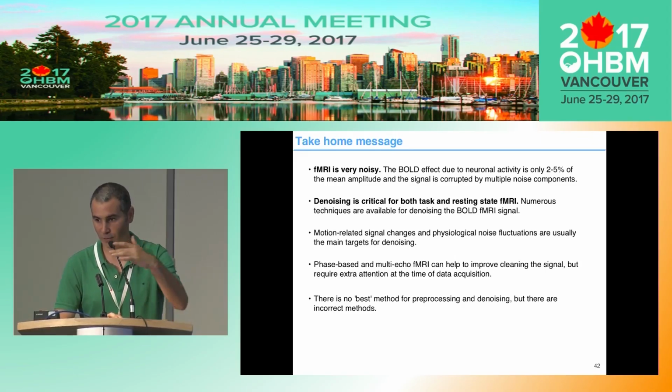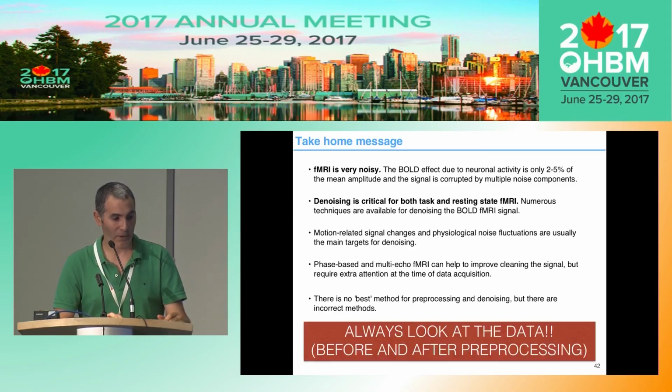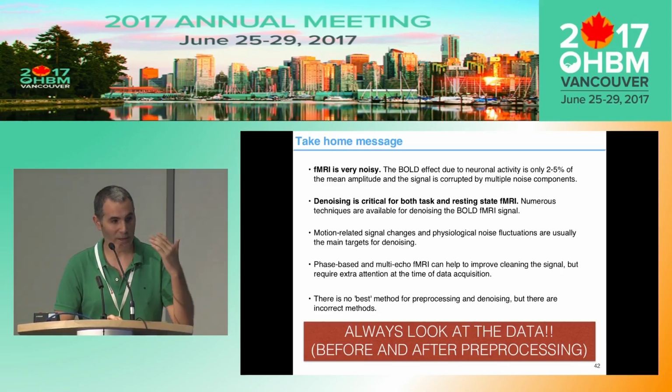That's why you will see the experts explaining how to implement these approaches, because it's very easy to apply them in an incorrect manner. As a final piece of advice, always look at the data before and after pre-processing, so you actually see whether you have artifacts in your data after all the pre-processing.